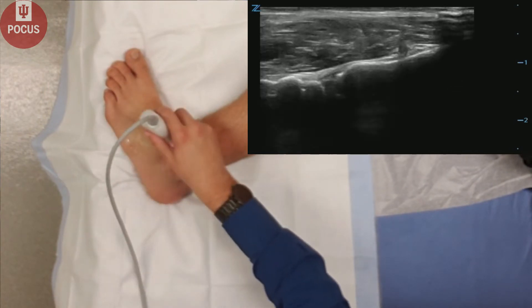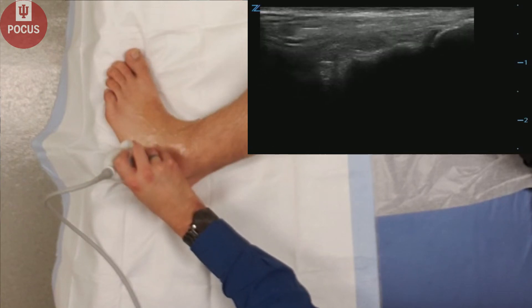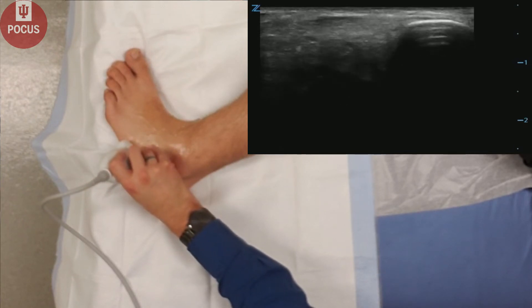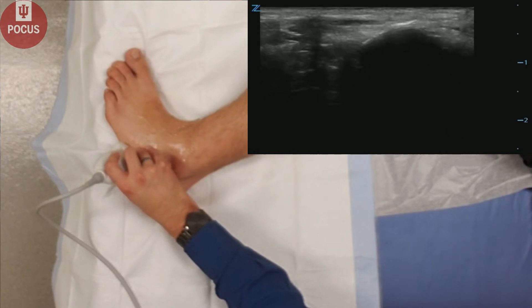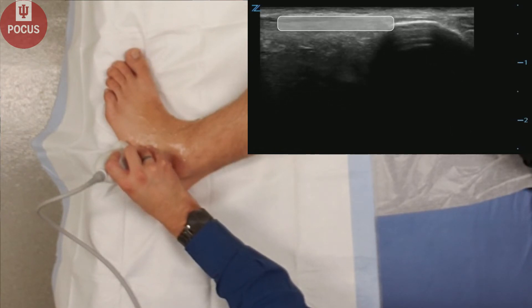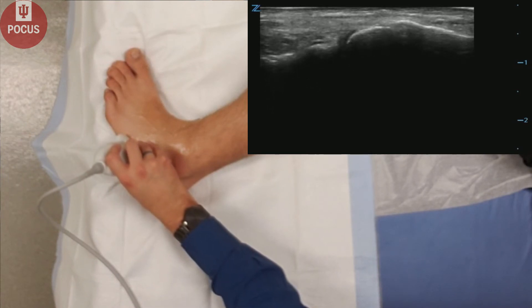We can also evaluate the fifth metatarsal. The proximal metatarsal is a common site of pathology. Right here is the peroneus brevis tendon as it inserts onto the fifth metatarsal, a common site of avulsion fractures.